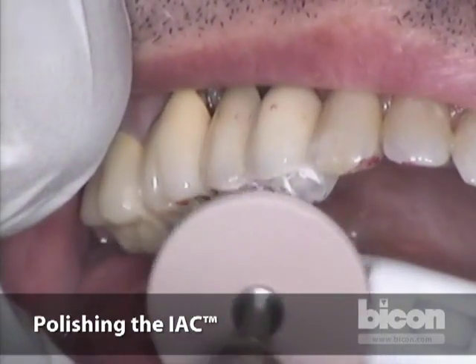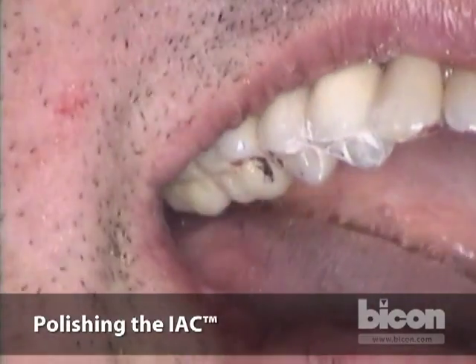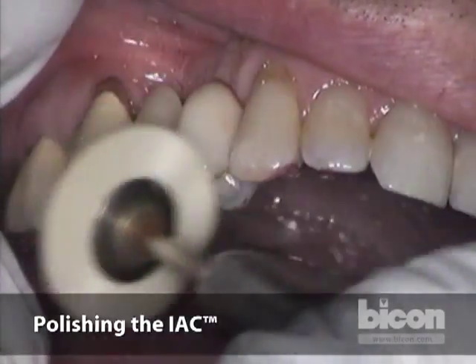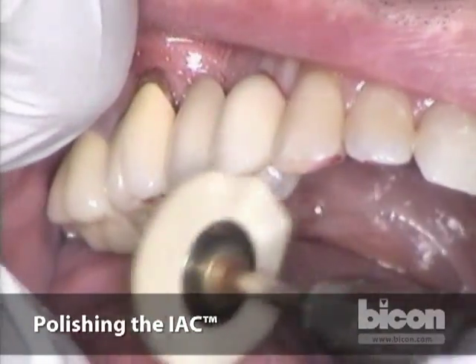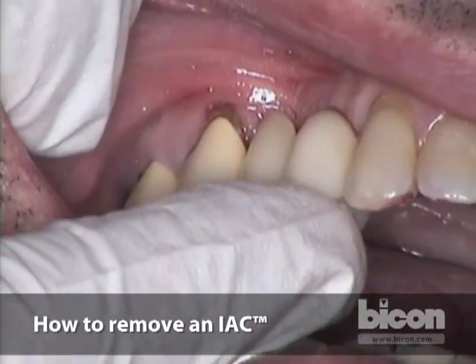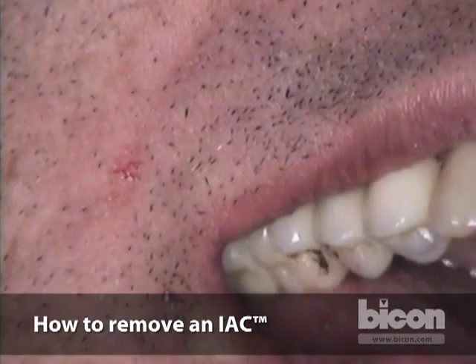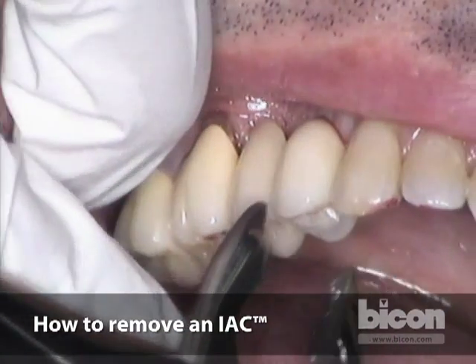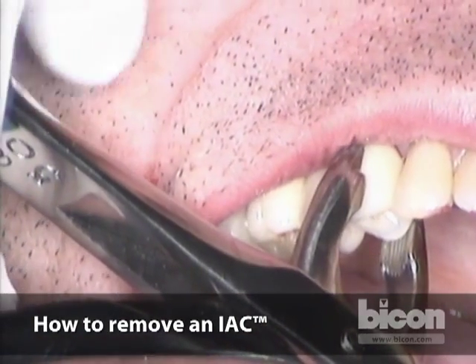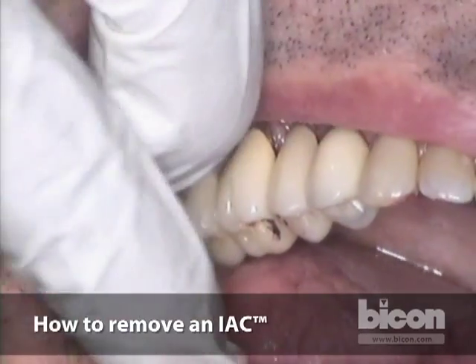Now I'm going to polish and finish with a polishing wheel. It's a really highly polishable composite resin — actually it has 10% of composite. It's a polyceramic with a highly polishable surface, and you achieve polishing very nicely. Even though it's definitively seated, you could remove this crown. Using the same crown removal forceps, grab the crown, then tap on it with a hammer or rotate a little bit and pull at the same time, and you'll be able to remove it.